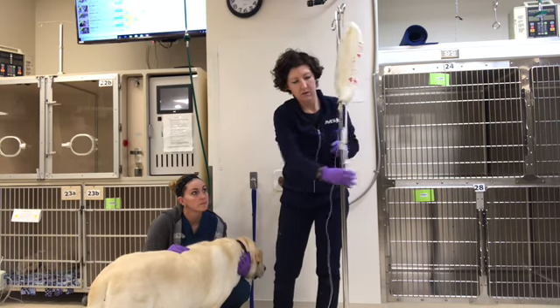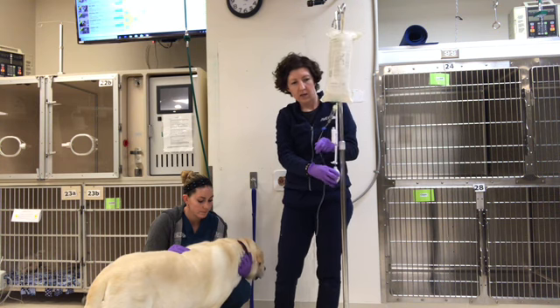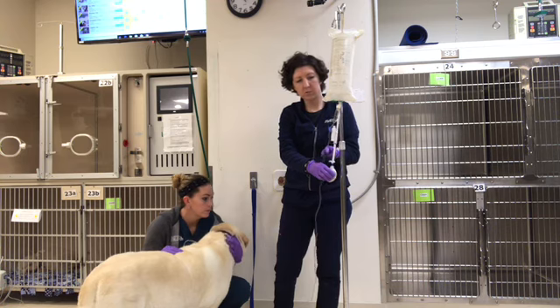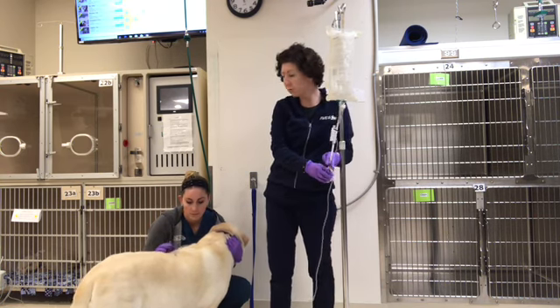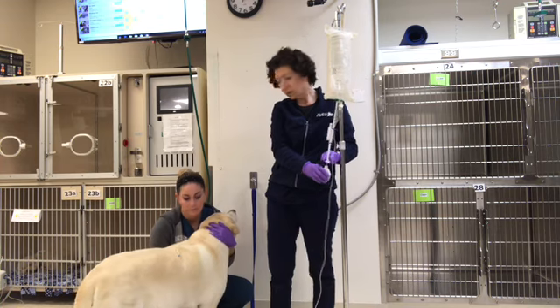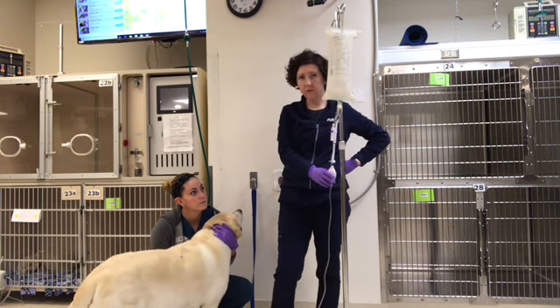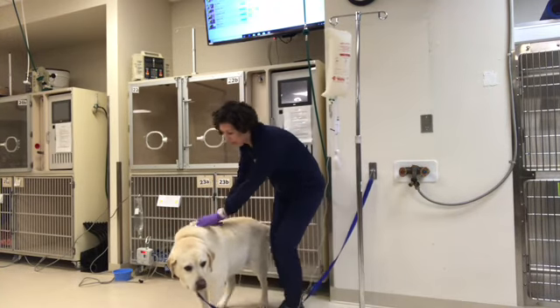and now I'm going to release the bag, and we're going to give 800 milliliters, and we will do it over a couple different areas just to make it a little more comfortable for him. Okay, so I will, when we're all done, I'll finish videotaping. Okay, so we're done delivering the 800 milliliters.